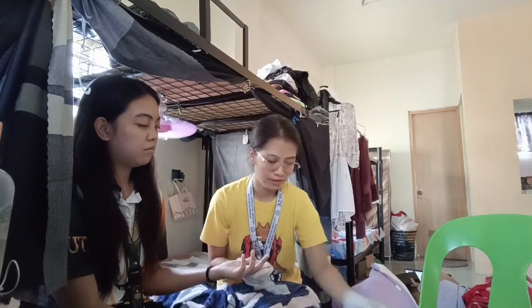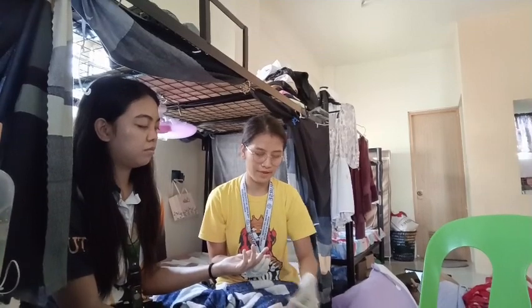Also, wipe away the first drop of blood with a gauze square or cotton ball if recommended by the manufacturer of the monitor. So, wipe muna natin first blood niya. The manufacturer recommends discarding the first drop of blood, which may be contaminated by serum or cleansing product, producing an inaccurate reading.